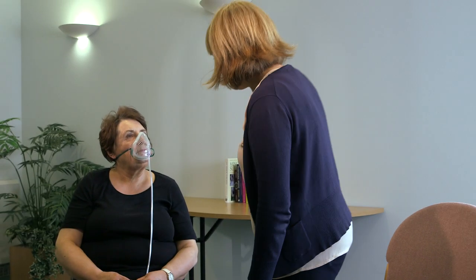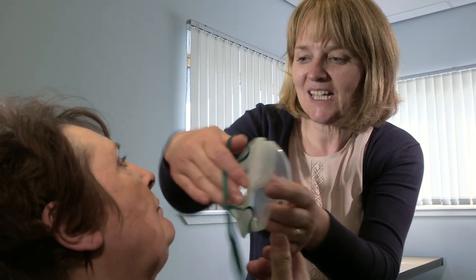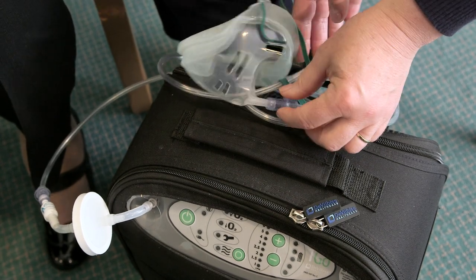I'll just leave you for the recommended time the doctor suggested and I'll come back in a wee while and check you. Okay, that's it Catherine, you're finished for today, so we'll just take your oxygen mask off gently — that's it, that's fine. We'll just switch the concentrator off. How are you feeling? Feeling fine, thank you. That's fine, so we'll just leave everything ready for the next time.